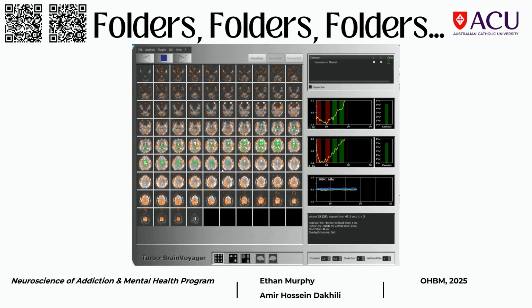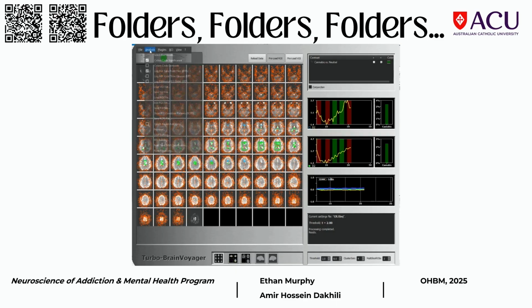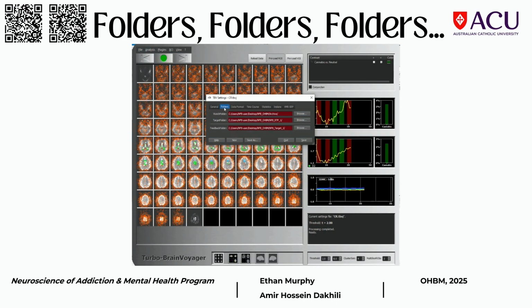One of the things also that can happen is we find with our MATLAB code, if it would crash or something would happen with the button box, and we didn't set up the run correctly, MATLAB would write an RTP into your, say, RTP1 or run1 RTP folder, which means when we go to set up the run again and we try to run it, it's going to crash because there's already data there.